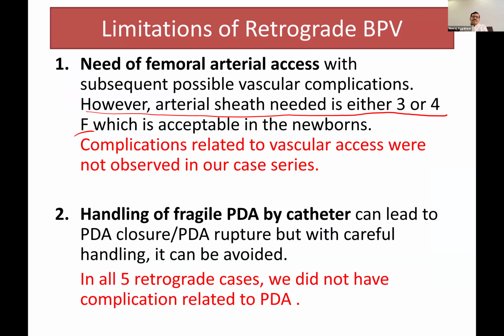We easily keep a 4 French sheath in the newborns. And in our series, we have not found any vascular access related complications. Then, handling of fragile PDA by catheter. Because your PDA child is ductal dependent, and you are handling the fragile PDA by catheter.